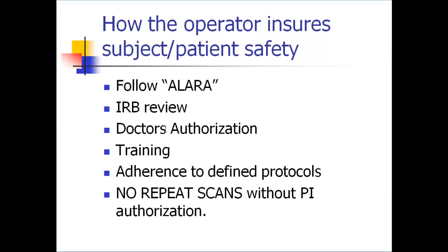We also have blanket coverage for anyone going through this operator training, because as part of operator training you have to do at least one scan, and typically operators who are going through the training will scan each other. There is then the training that you're going through now that helps ensure subject and patient safety, adherence to defined protocols. Whichever protocols are going to be used in the study or the way that you're going to use the DXA, you need to adhere to that.